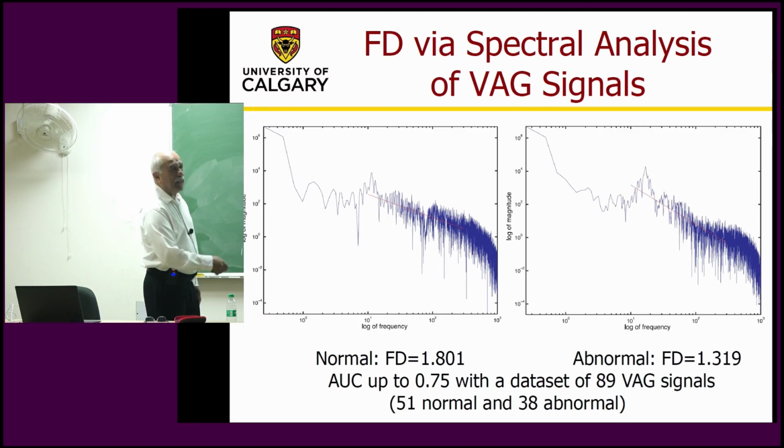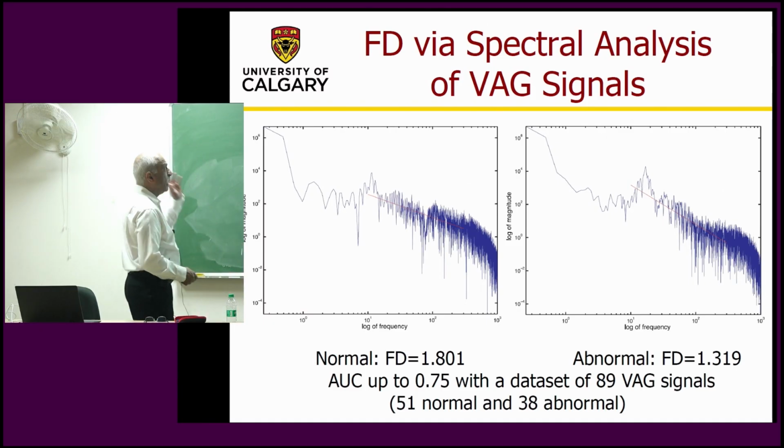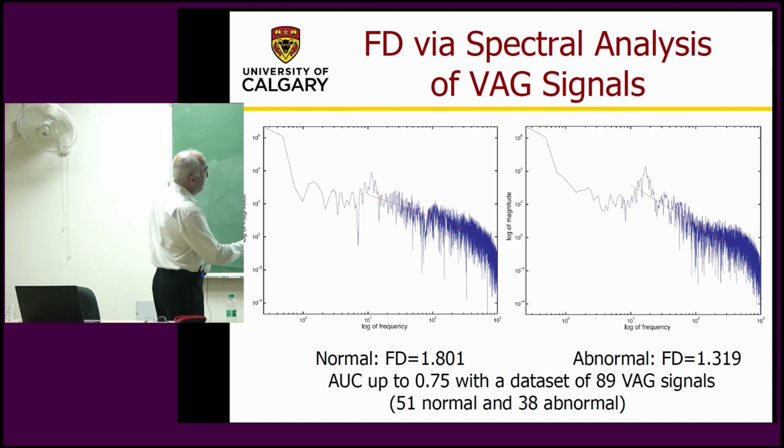Perhaps after 200-300 hertz, it's all noise. So we took this band to be the significant band, from about 20 hertz to about, what's the band? It's somewhere there, 20 to 300 or something like that. So the line fit is shown there.